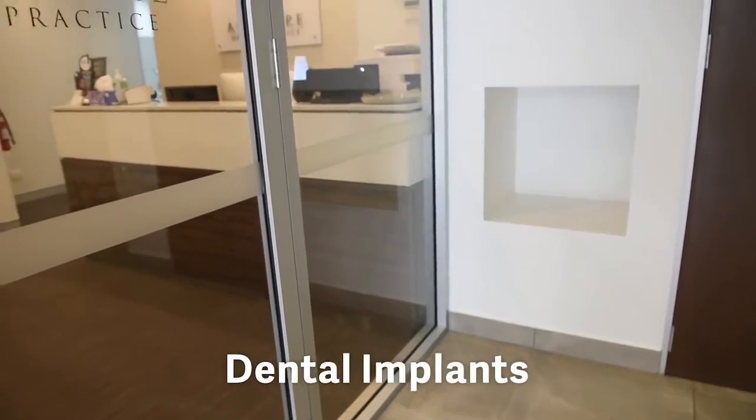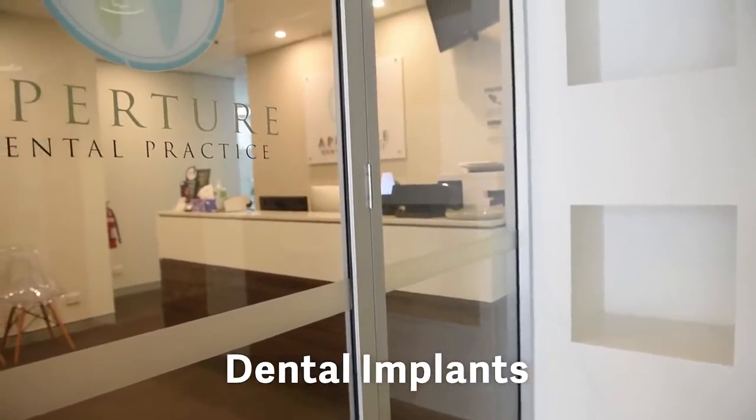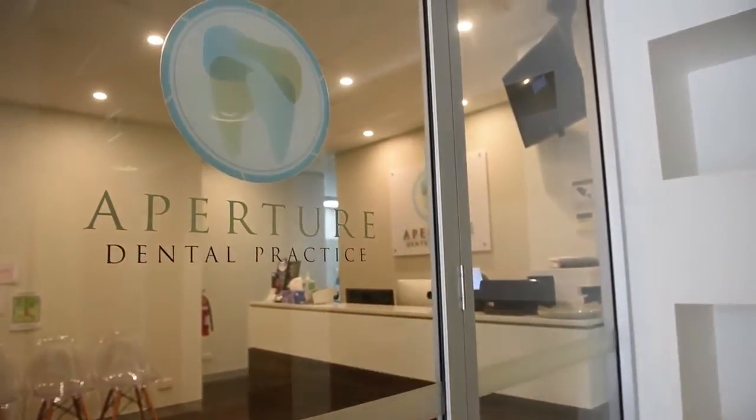A dental implant is like a screw, and this screw is screwed into your jawbone. Once it is screwed into your jawbone, it sits in very tightly. And once it is integrated or healed into the jawbone, then you can put in a tooth that goes onto the implant, something like this.